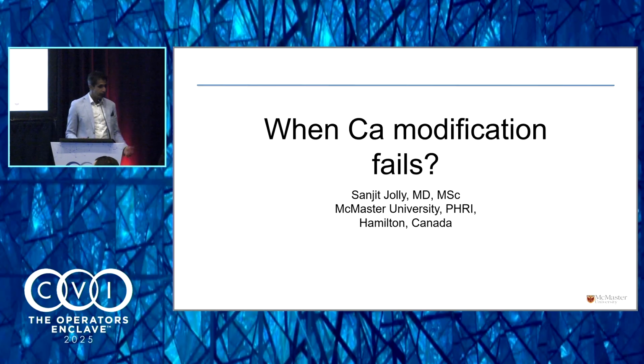You can use, we've had Ringer balloon in Canada for a number of years, a fantastic device in terms of perfusion and stopping the bleeding, ping pong guide, and covered stent. I think one of the challenges with covered stents in nodular disease is you can have trouble expanding that covered stent, and it can be challenging to create hemostasis. But there's certainly a perforation rate, and we know in calcified disease there's a higher rate. A 1% perforation rate in calcified disease is probably pretty standard. Whether you look at rota, orbital may be a little higher. We don't know where OPN NC stacks up compared to those.